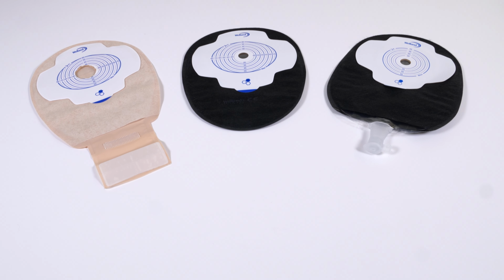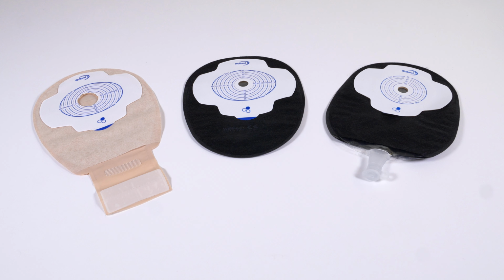Before changing your stoma pouch and removing your old pouch, the first step, if you're using a drainable or a urostomy pouch, is to empty it. Closed pouches are designed to be removed and disposed of after each use, so there's no need to empty them unless you prefer to cut open and empty the contents before disposal.